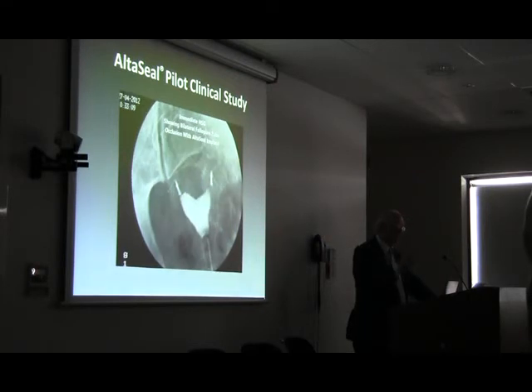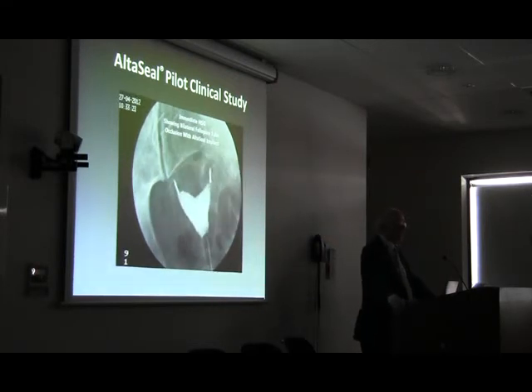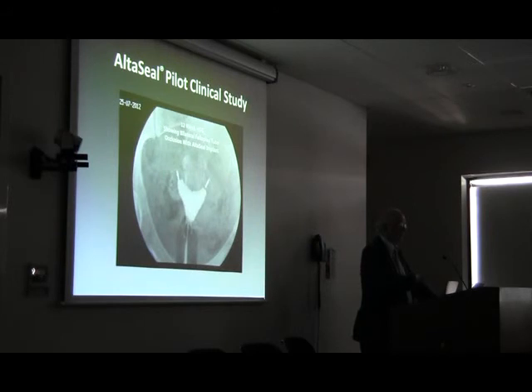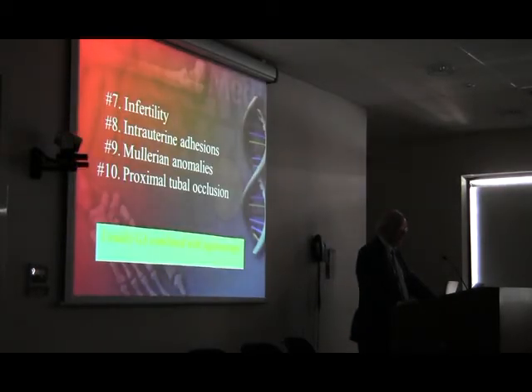For the Essure, they're now using ultrasound to check for tubal occlusion and correct placement of the devices. So this seems to be perfectly okay. But just from the study point of view, people have the tubal occlusions confirmed. Anyway, moving on.